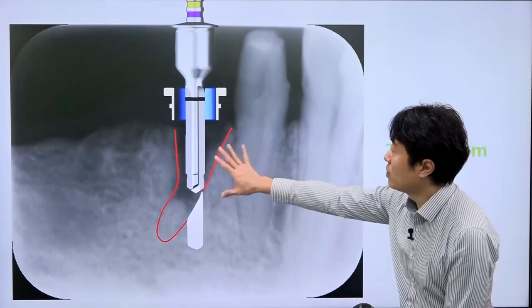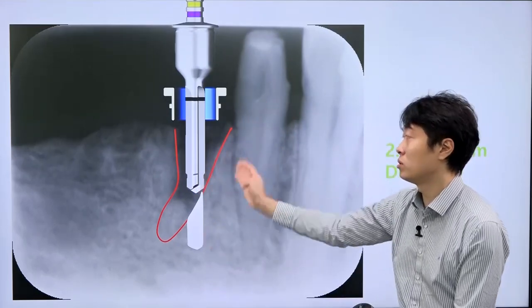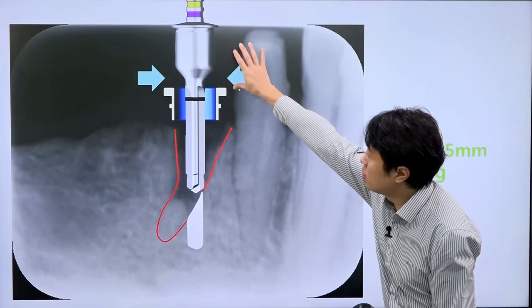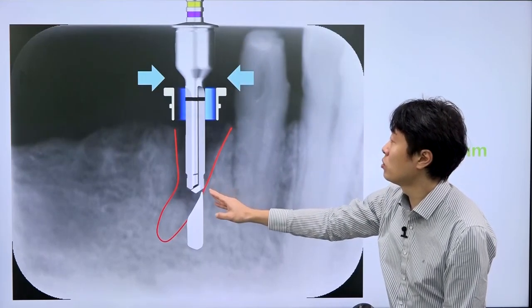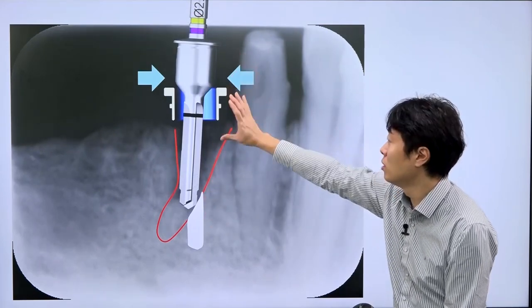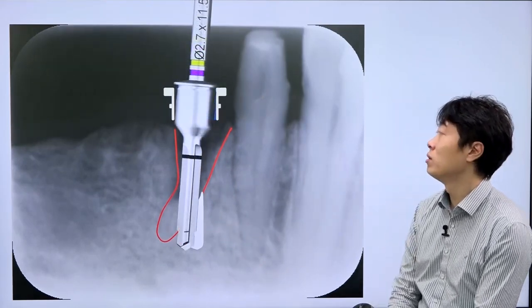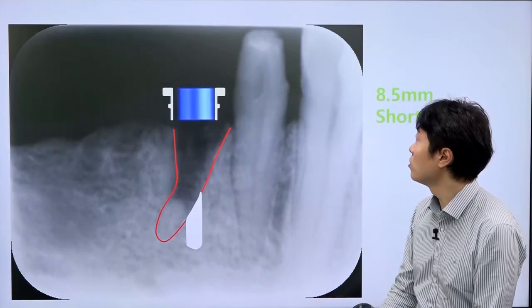So especially in immediate implantation, many cases involve inclined cortical bones. In this case, especially in an unguided state, when bone reduction begins, the drill slips after bouncing on both sides. Here too, it's not guided. When it is drilled after it has slipped, as I mentioned before, drilling will be done slightly crookedly. The surgery will not proceed as intended.